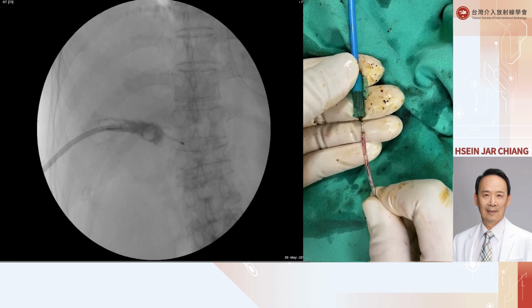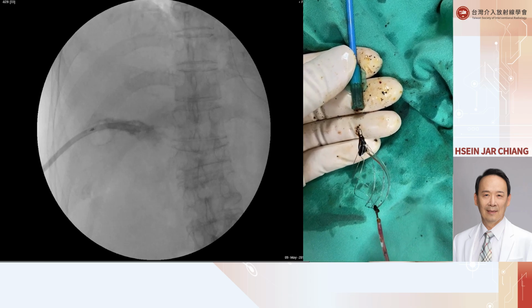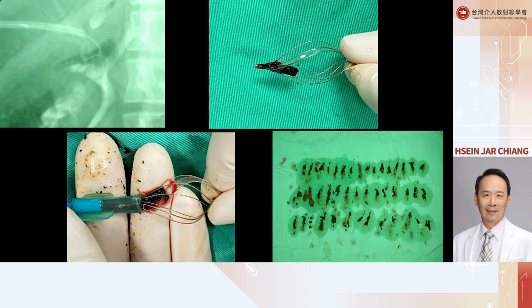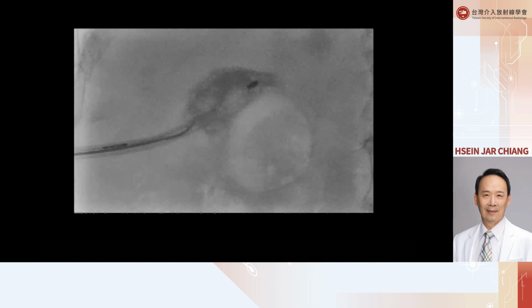It won't penetrate the bile duct or the gallbladder. So you see, once you catch the stone and pull it back, the stone will be broken very easily. When the basket comes out, you will find the stone in the basket. So you can repeat the same procedure, and finally we remove all the stone in small pieces, fragments. If you have a hard stone that cannot be broken by pulling the basket, you use the stick to hit the stone, and it will be broken very easily.